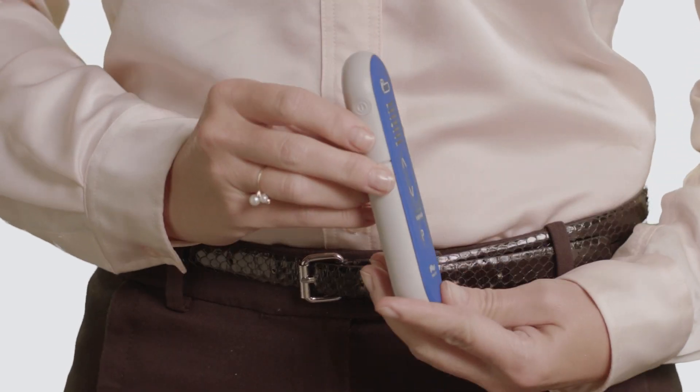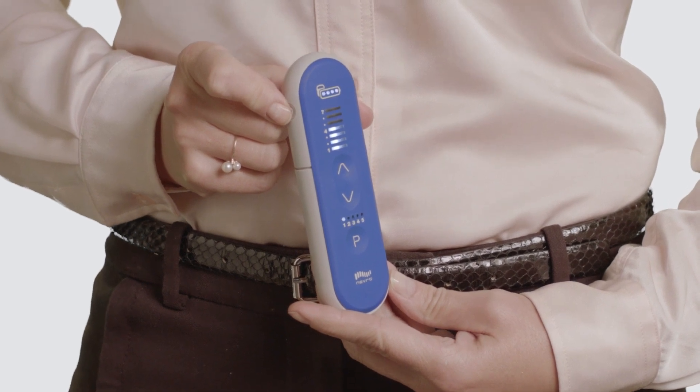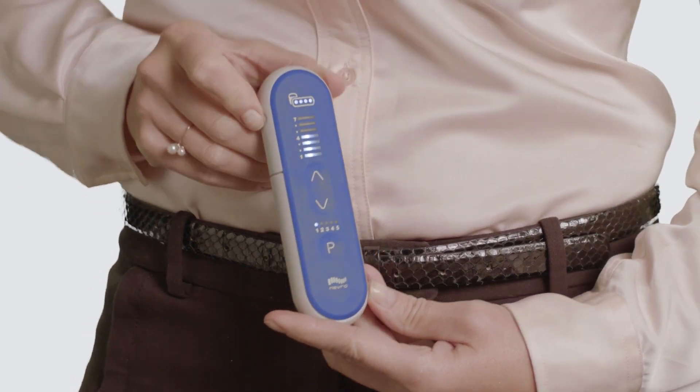You must first turn on the remote. Press and hold the on/off button on the side of the remote for five seconds. You will hear one long beep when the remote has connected to the device.